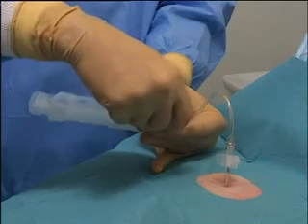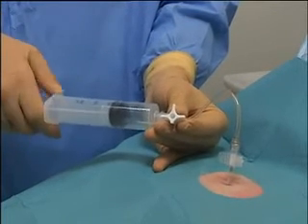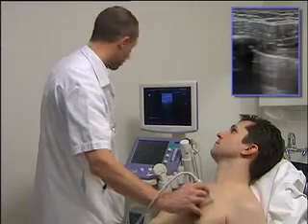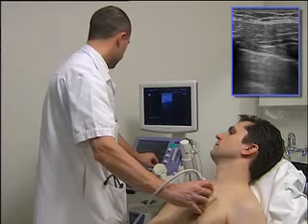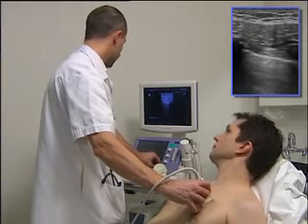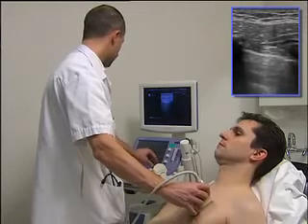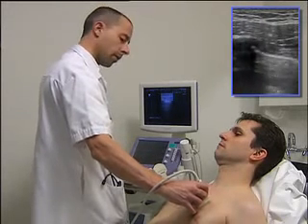This video reviews the techniques and equipment required to perform needle aspiration of primary spontaneous pneumothorax in adults. Ultrasonography can be helpful in confirming the presence of pneumothorax, in locating the landmarks for catheter insertion, and in determining the depth of catheter insertion. Since local practices and equipment availability vary greatly, ultrasound-guided insertion will not be addressed in this video.